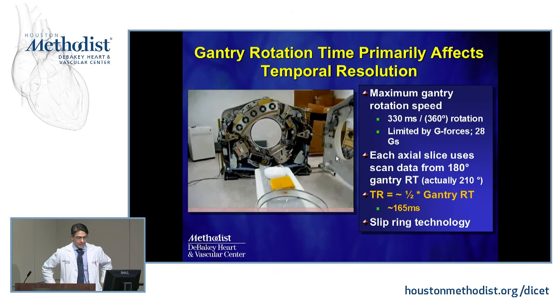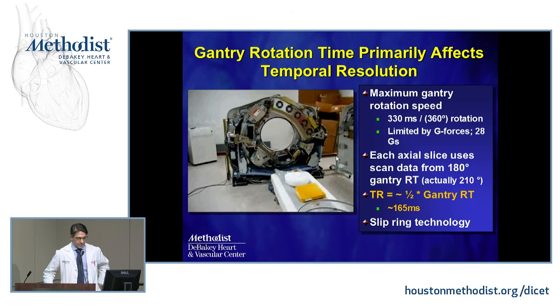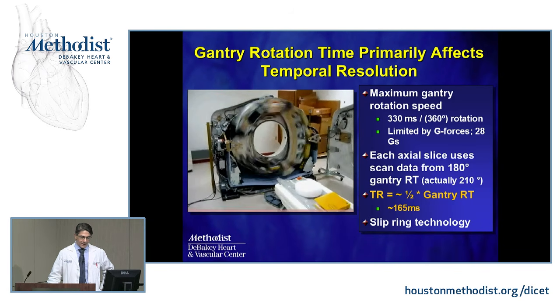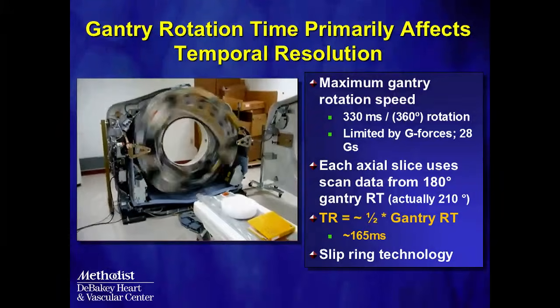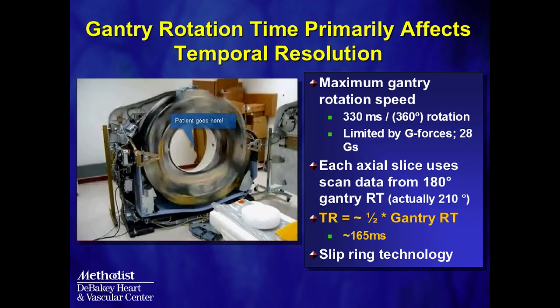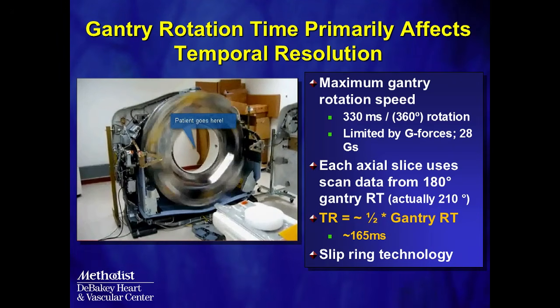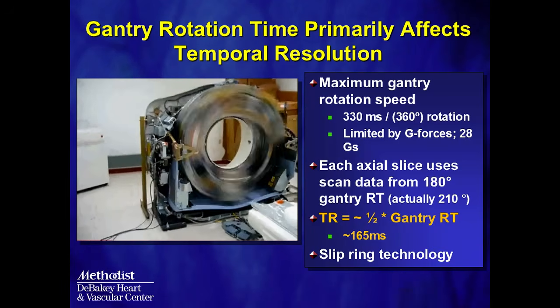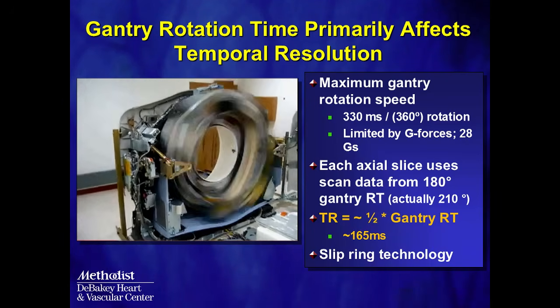So I thought I should show you what it looks like to see a gantry spinning around, and I don't think any of us would put our heads in there if we knew what was going on behind that cover. You can see there is a tremendous amount of force being generated here. They say up to 28 Gs.